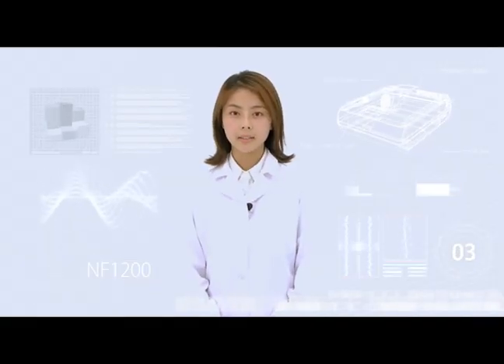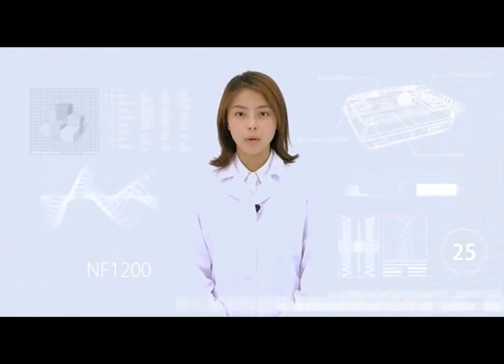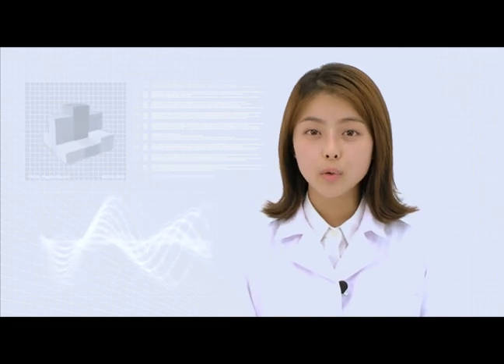When you are on the scene of a sudden cardiac arrest, do not hesitate. Call 911, then get an AED. You would be more effective in saving lives if you are trained on how to use an AED and do CPR.